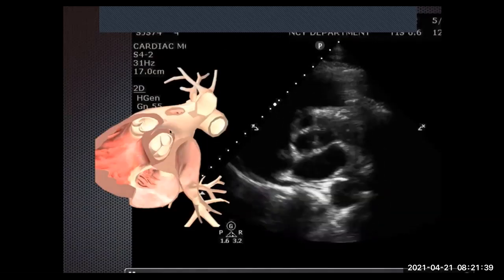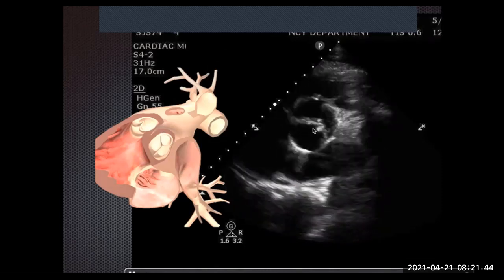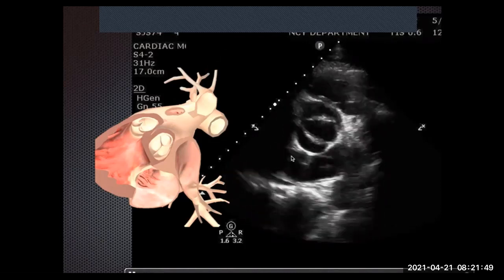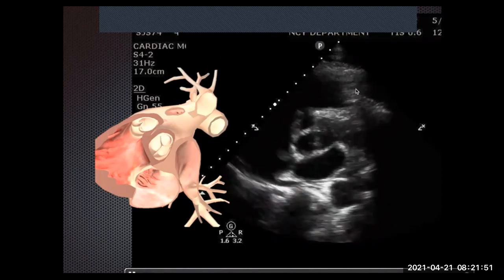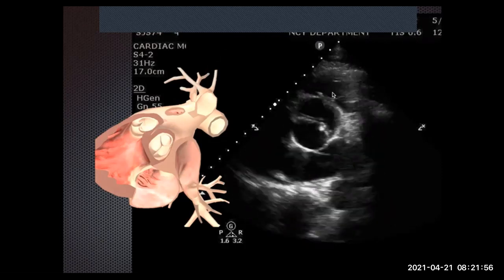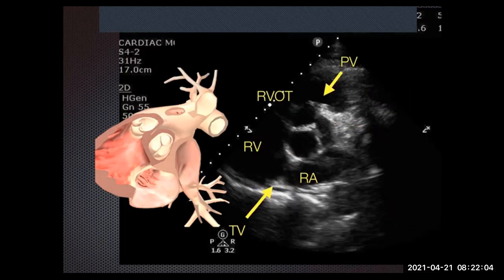And then as you scroll up to look at the tri-leaflet aortic valve, this is the Mercedes-Benz line. You have your right atrium here, tricuspid valve here, right ventricle going through. You can see a hint of the pulmonic valve as well. So anatomically, you're looking at the 3 leaflets of the aortic valve, and then these are the other structures that may be important for some of the other pathologies that you might look for, such as an embolus, etc.